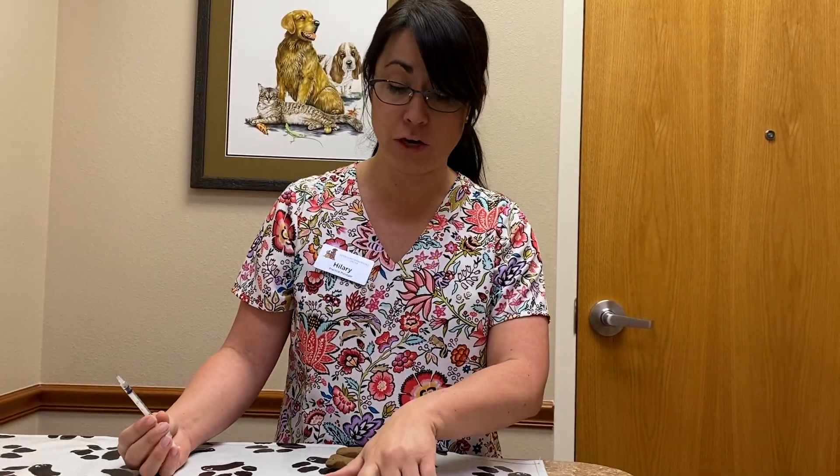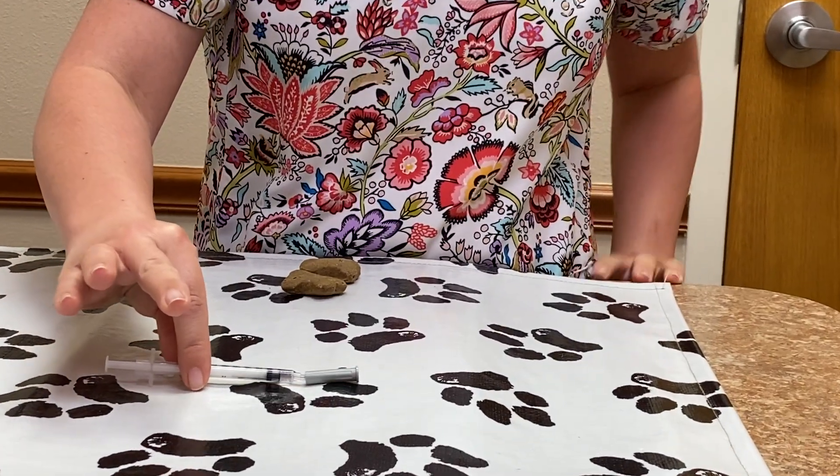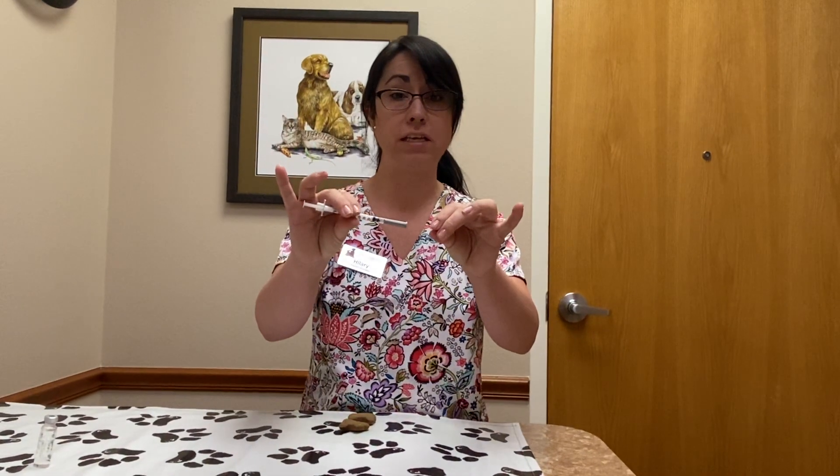Lay your lid flat on a surface and use one hand to cover the point of the needle, then use your other hand to finish capping it. The reason we recommend this is that if you try to cap it the other way, you may accidentally poke yourself — and that really hurts.